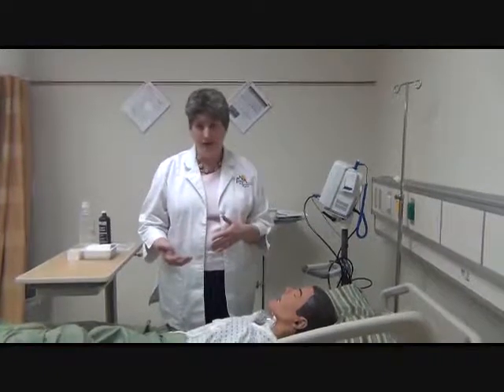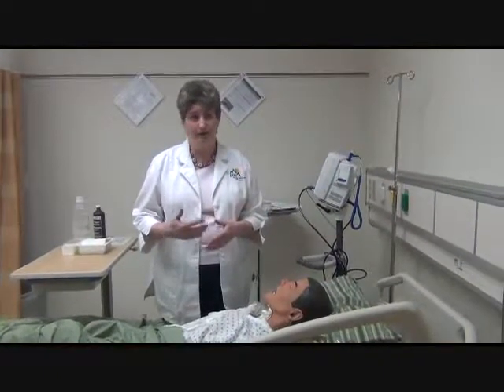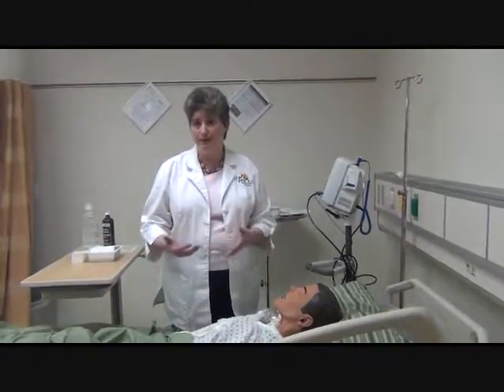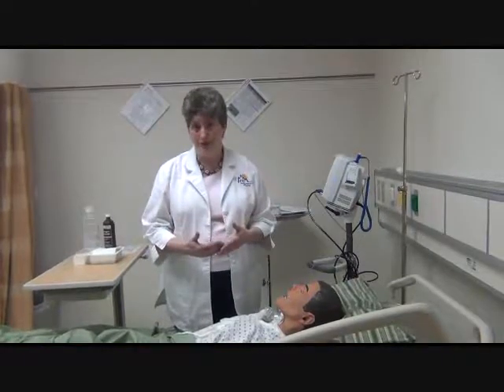If you're not used to doing trach care, a lot of times you're going to be by yourself, so I would recommend that you practice as if you're by yourself, but also practice with somebody, and you tell them what you need them to do.